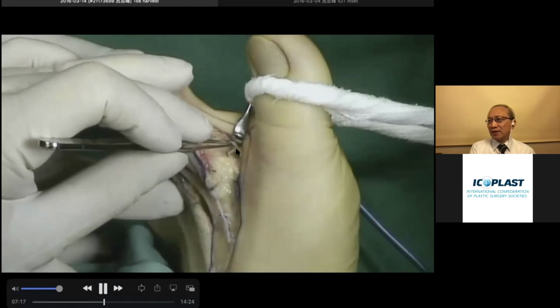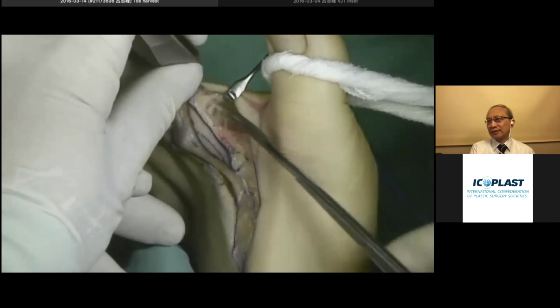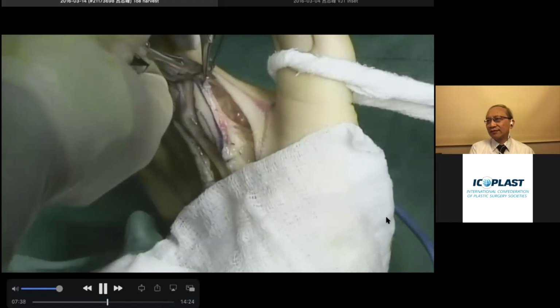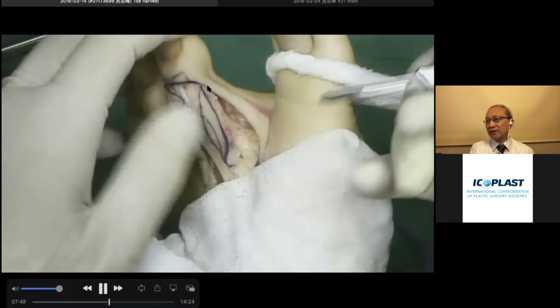They are usually around 0.5 to 1 millimeter, with an artery and also a concomitant vein. So continue dissecting the vein and the artery distally, then ligate the distal runoff and cut the distal runoff. When we do the osteotomy from here, the vessel will already be disrupted.